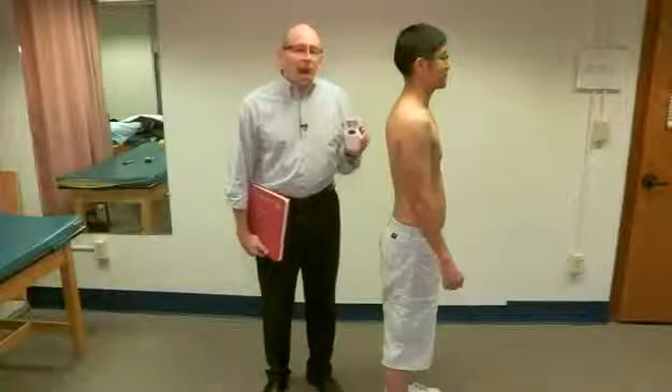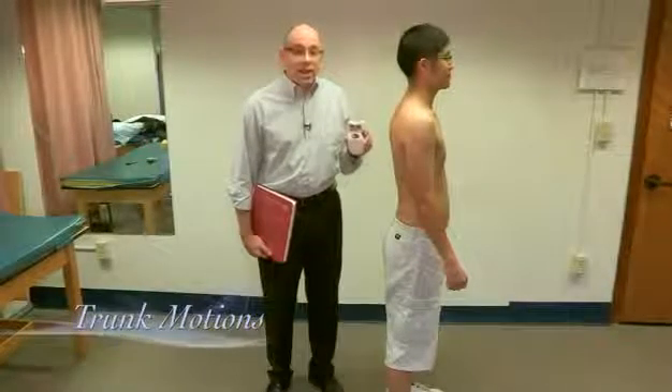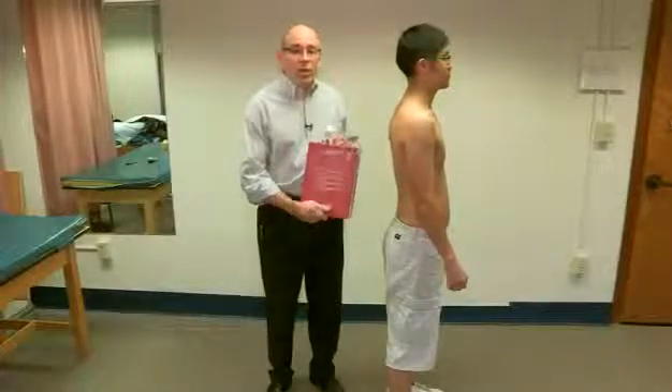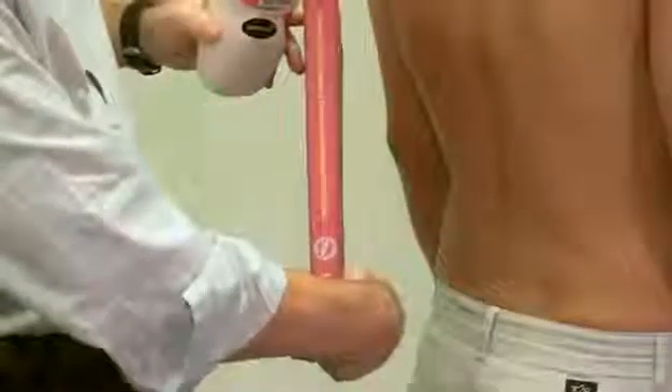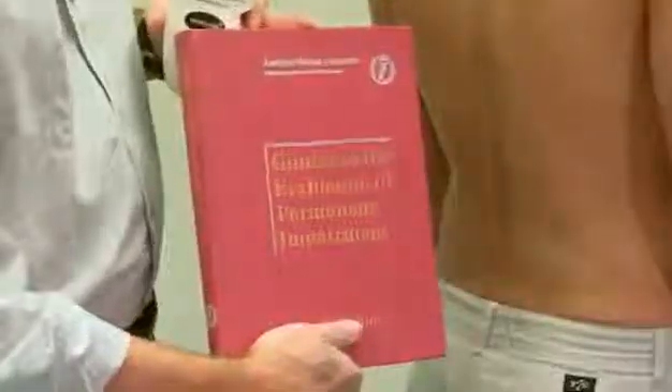We're going to continue using the inclinometer, but now to measure trunk motions: flexion, extension, and lateral flexion. It's worth noting that the procedures we use are adapted from those described in the Guide to the Evaluation of Permanent Impairment, 4th Edition, from the American Medical Association.